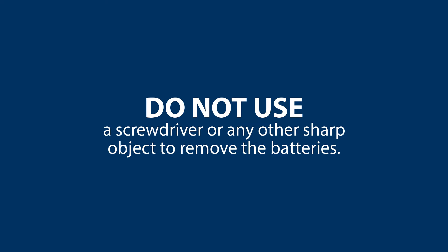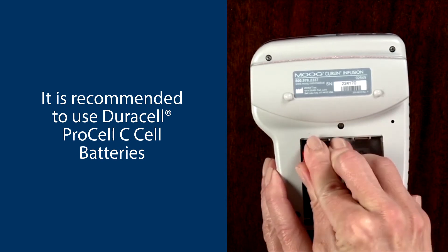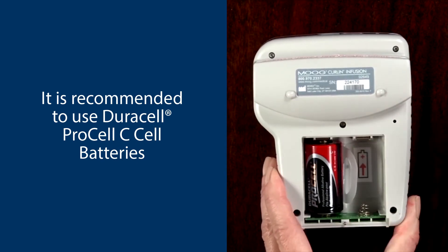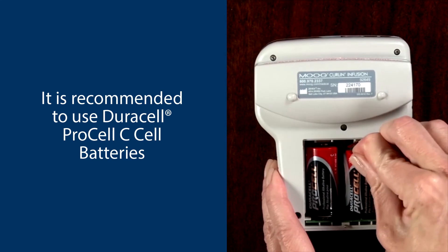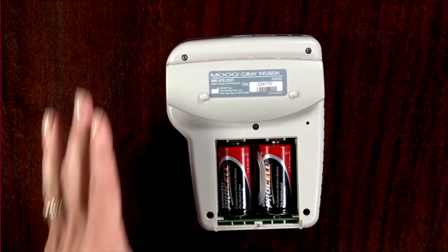Do not use a screwdriver or any other sharp object to remove the batteries. Now place the batteries bottom side first into the pump. This ensures that the springs come in contact with the bottom of the batteries. Notice that both positive poles must be at the top of the battery compartment.